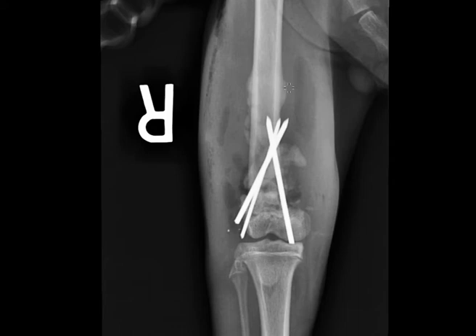The last thing I'll point out about this fracture is that you can see that over time, and the time that's elapsed here, guys, we're looking at about a month from the original fracture to this revised fracture repair. You can see that periosteal reaction has formed. It's quite common with complicated fractures where substantial fracture reduction is needed for there to be periosteal trauma that can happen either with the initial injury with soft tissues or during the fracture repair itself. So having a little bit of a periosteal reaction can happen even distant from the original fracture site. The other thing that can lead to periosteal reaction in healing fracture, of course, is infection. And we know that the soft tissues initially were infected, although this patient has been treated adequately for that.